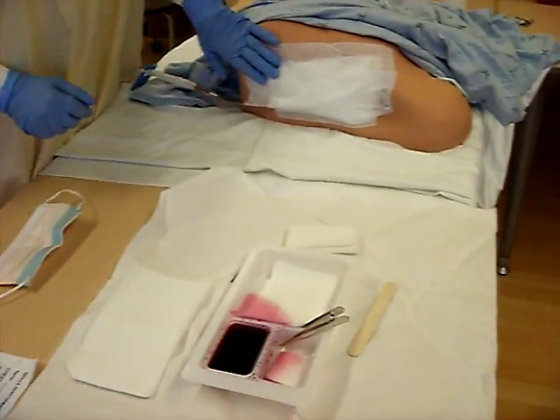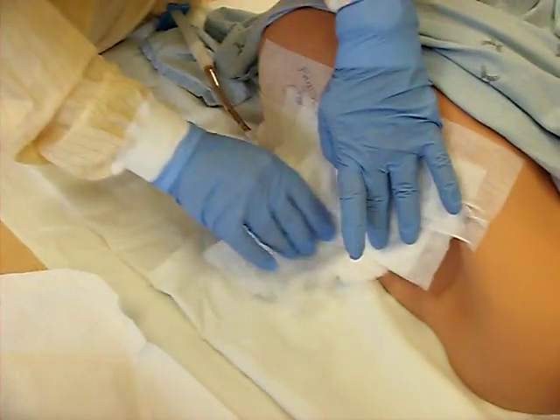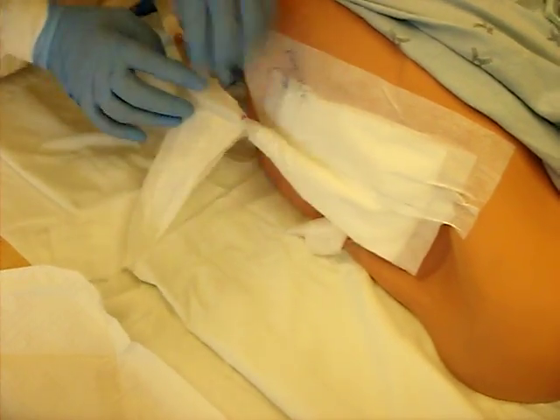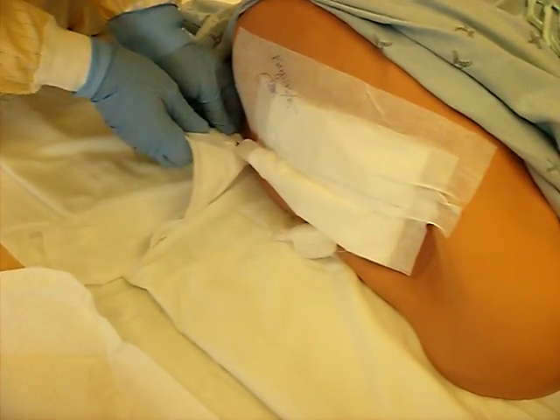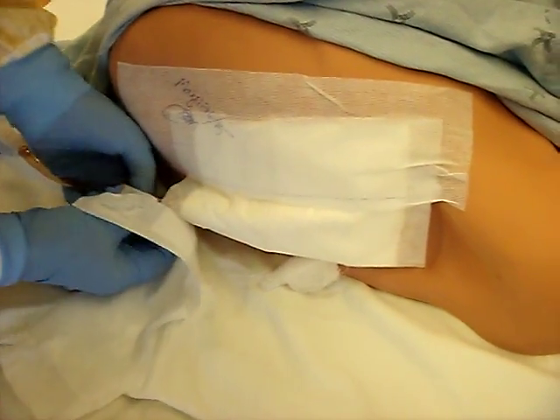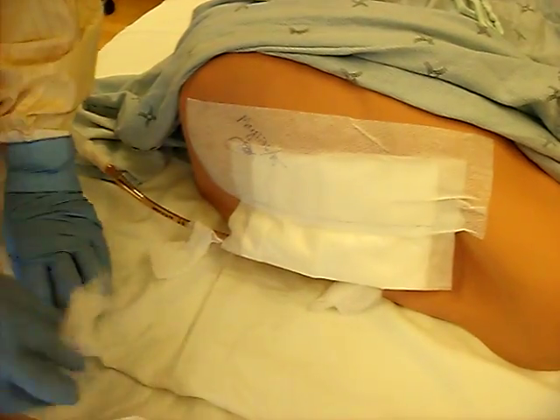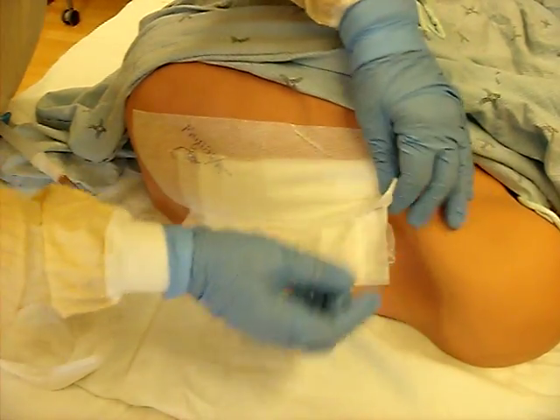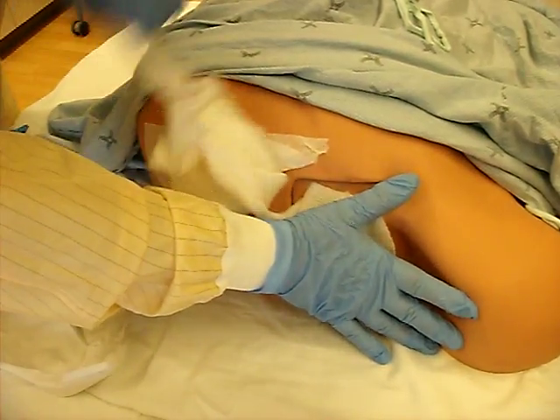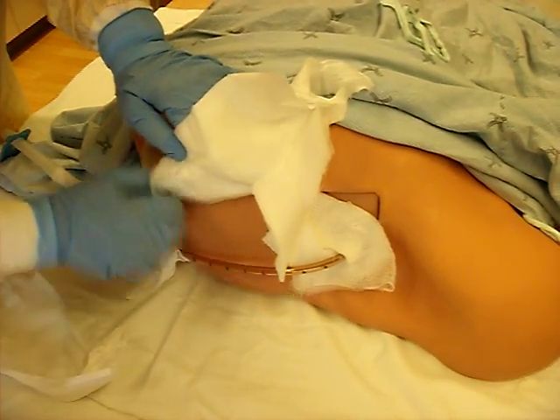Alright, so we go down to the chest tube, and once you remove the dressing, it's usually a Hypofix combination with gauze and a few other ABD pads. Sometimes they're going to be sticky. Now, you can be gentle, but remember that these tubes are often affixed well, they should be, with a suture, which means that you're not going to dislodge the tube, but you want to be careful you don't do too much pulling. It's going to be a little uncomfortable on the ribs.